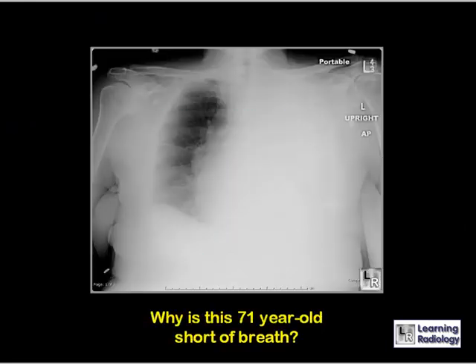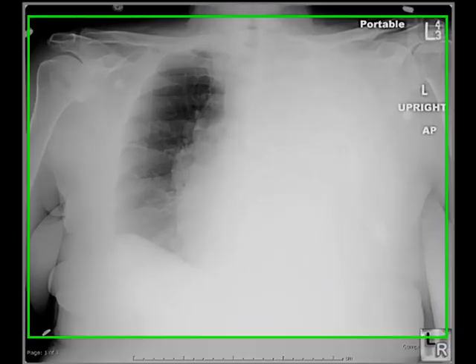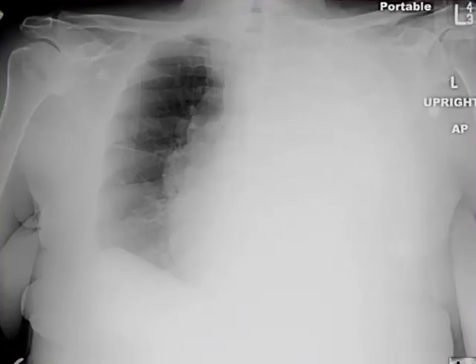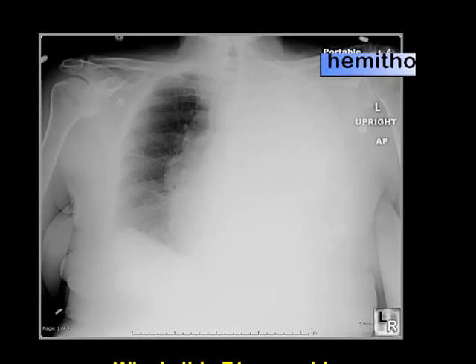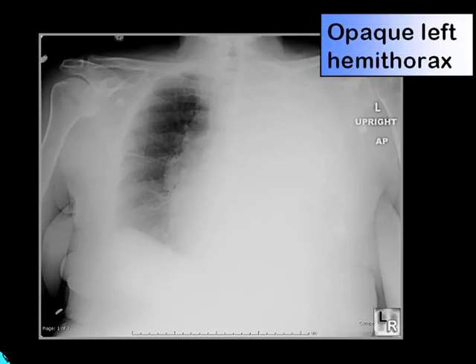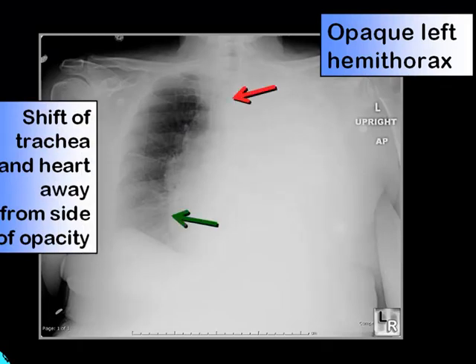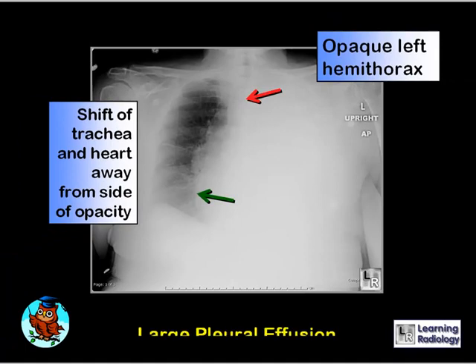Why is this 71-year-old short of breath? There is an opacified left hemithorax with a shift of the trachea and the heart away from the side of opacification, indicating something is occupying space on the left — this is indicative of a large left pleural effusion. In this case it was due to an underlying bronchogenic carcinoma.